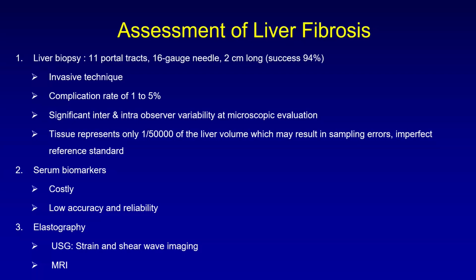Elastography, yes. Ultrasound strain and shear wave has been around for a long time now. And MR elastography is the new kid on the block, and we need to evaluate whether it can be used for all practical purposes or not.